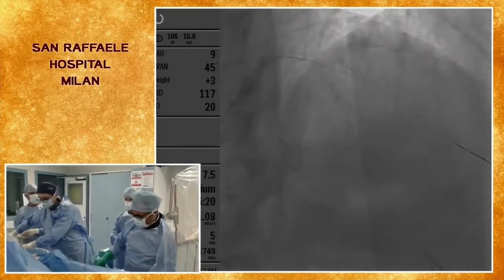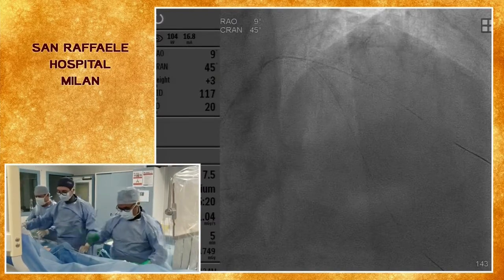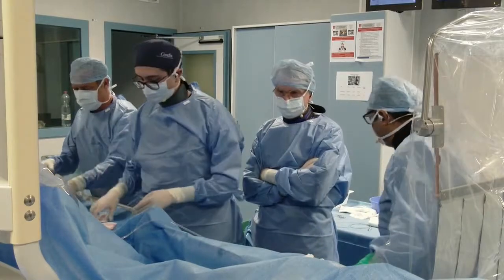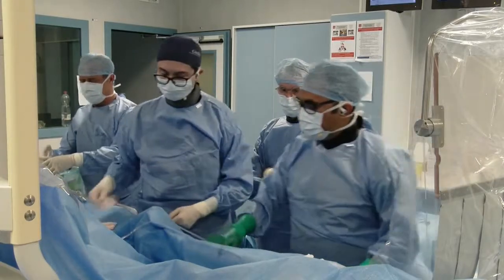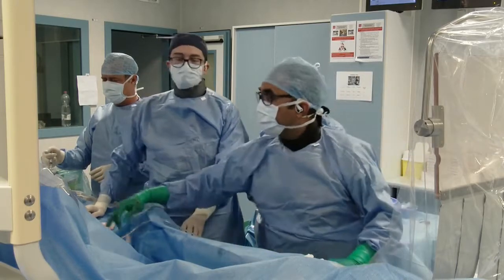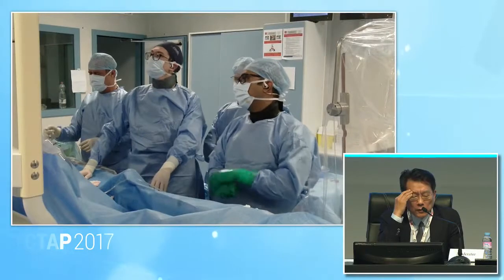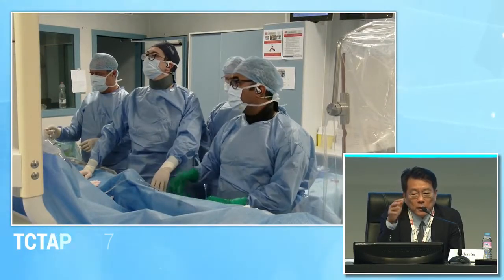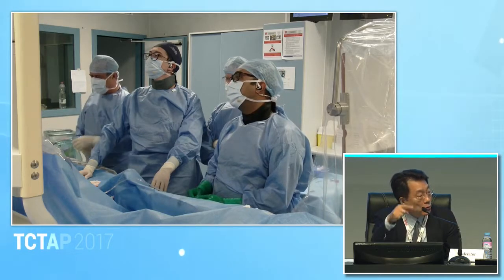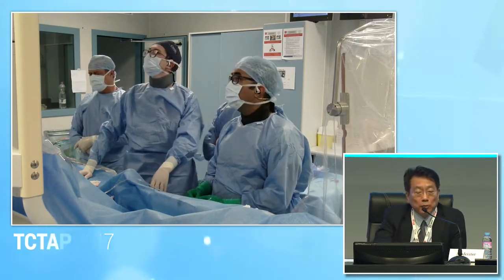Will you finish with a double culotte, or will you not? If you look at the IVUS findings in the second distal part of the LAD area, there are some plaque and some ruptures with balloon inflation. However, the minimal lumen area is quite good. Proximal LAD has some encircling calcium. However, the minimal lumen area is still good.